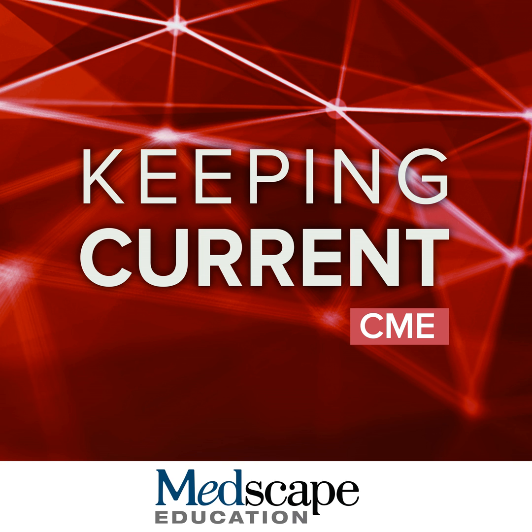For ARIA-H detection, gradient echo has been used in clinical trials, and that is the sequence on which ARIA-H severity scoring is based. However, susceptibility-weighted imaging is more sensitive and desired in many clinical practices. And it should just be noted that with the use of SWI, more microhemorrhages may be detected, and that may result in a more conservative treatment approach.